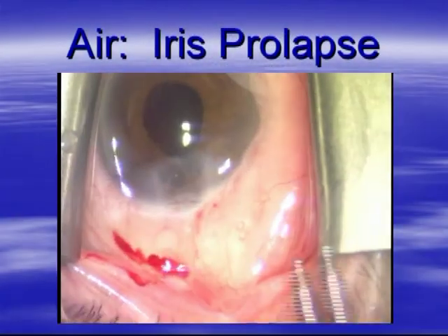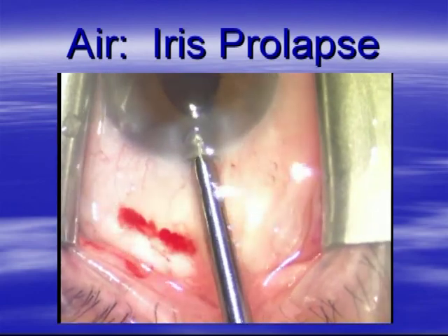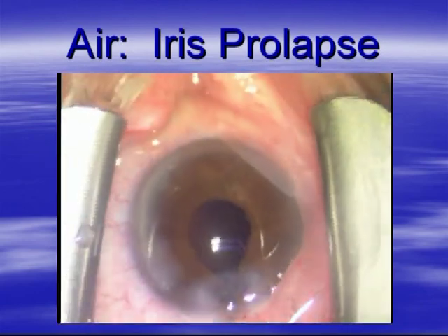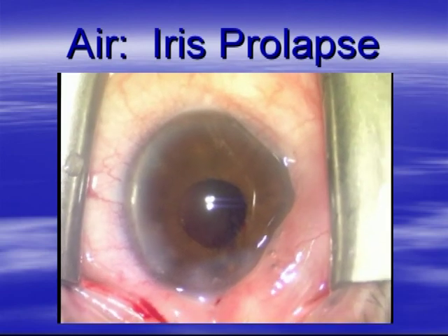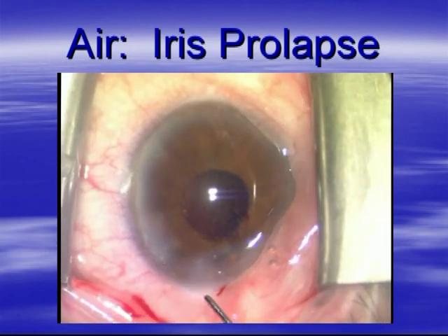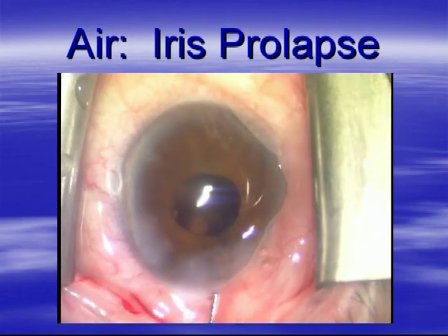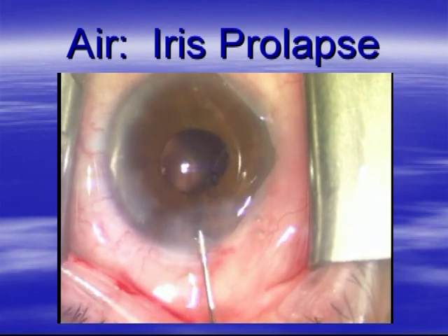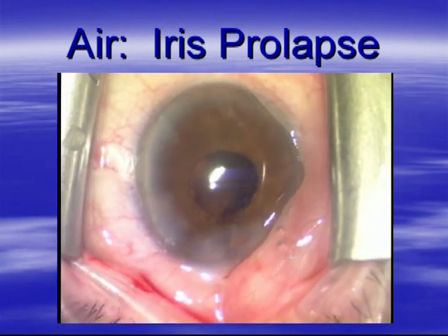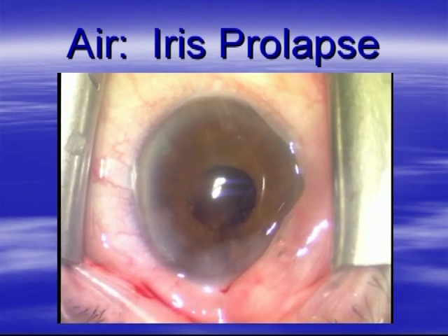Well, here we are. We're almost done with this surgical case. We've just got a little cortex left, and I really can't even get the INA handpiece, the INA tip, back into the eye just to get to those 2 little bits of cortex. Well, this lady was a little bit offended for some reason when I asked her about whether she was on medications for her prostate. Not really sure why, but actually this lady did predate our knowledge that alpha-adrenergic blockers can cause the IFIS syndrome.